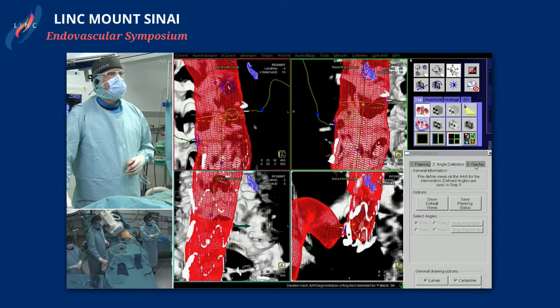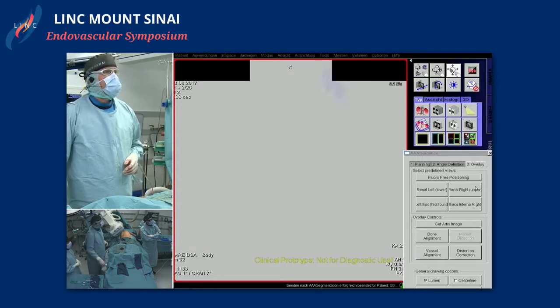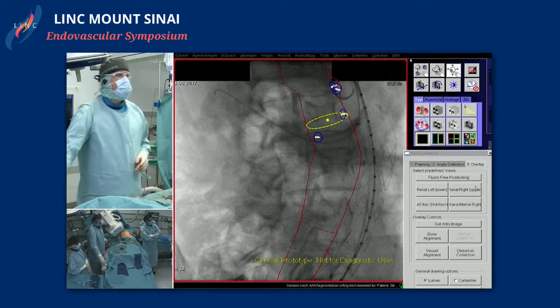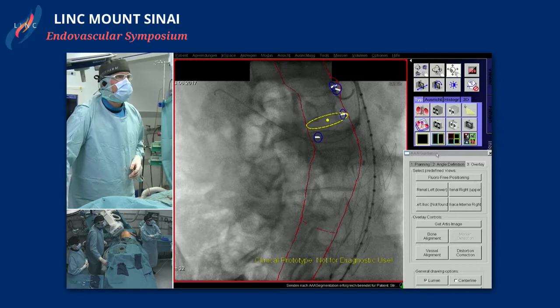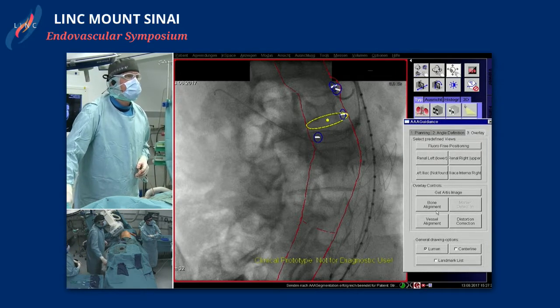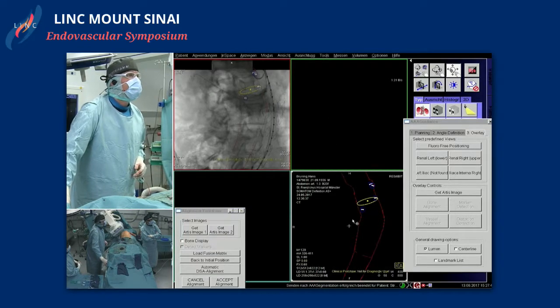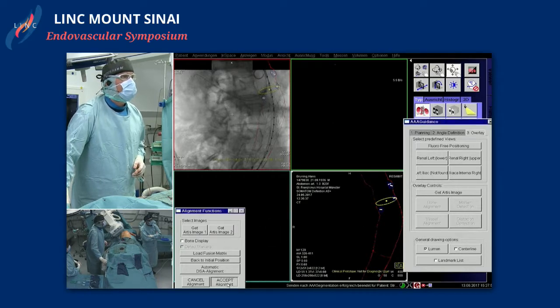And then we go to the overlay function, and we have a look at how it works. So maybe, yeah, you can see it doesn't work too well at the moment. We have to correct this. Sometimes it works very well, sometimes not, but I can correct this now a little bit. Maybe like this. And then we can go ahead.